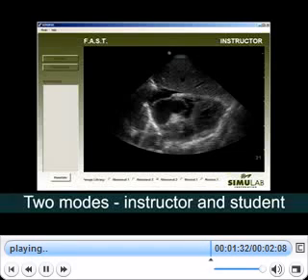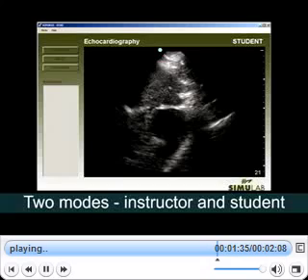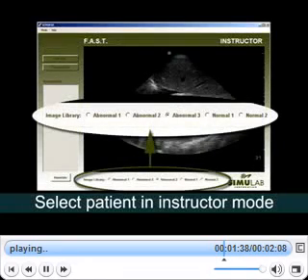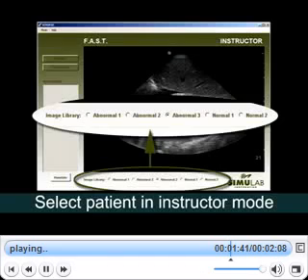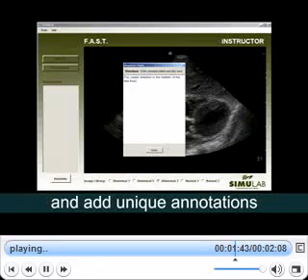All modules include two modes: instructor, which is the teaching mode, and student, which is the testing mode. In the instructor mode, the user can select a specific patient's images and video and add annotations, which can be saved for future reference.